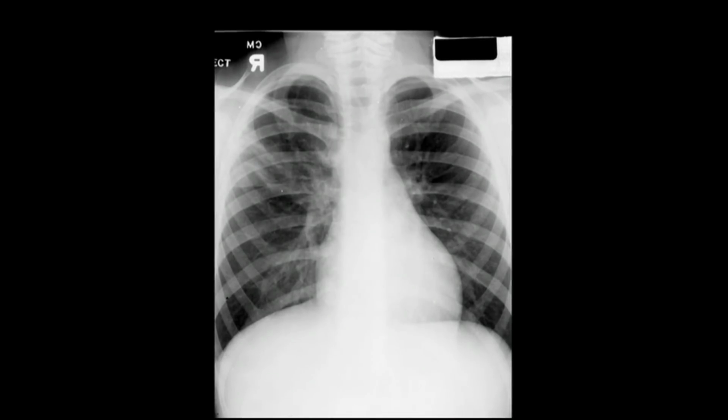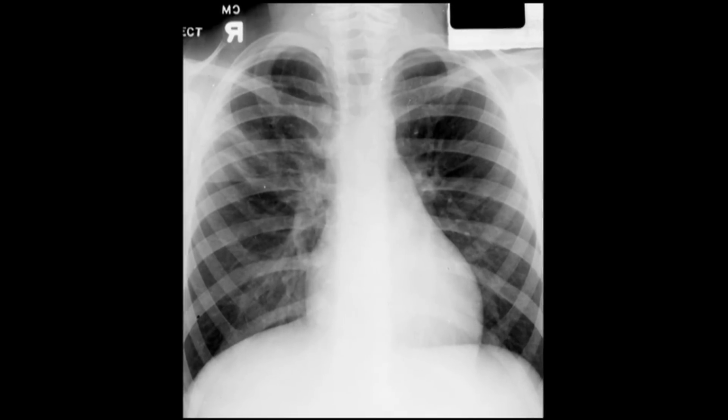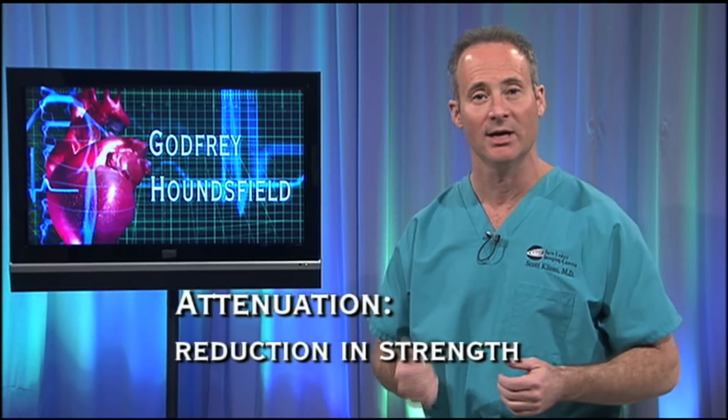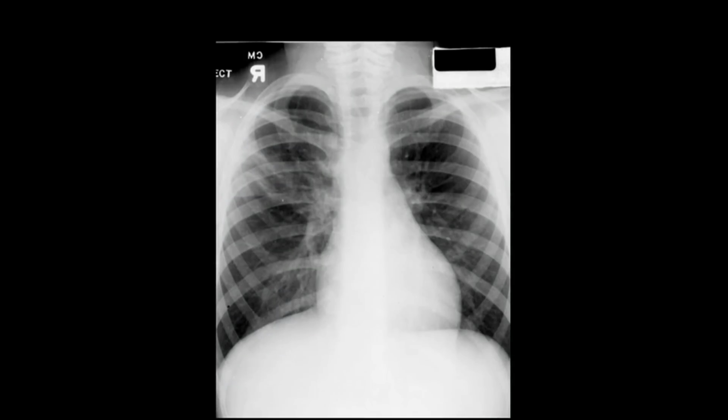If we had all the X-rays pass through the body, everything would look very dark and you wouldn't be able to tell one structure from the other. Another limitation of the standard radiographic technique is contrast resolution. A sheet of film is intrinsically a very poor medium for recording the different values of X-ray attenuation. There are basically 5 densities that we can see on a standard sheet of film. Starting from the least dense, you have air. Air shows up very black.